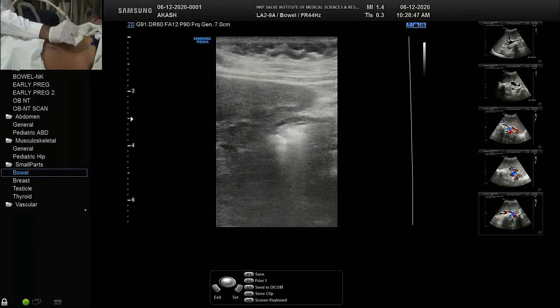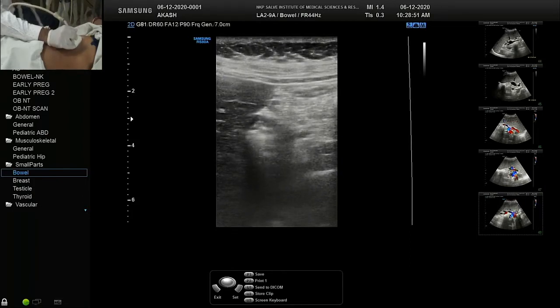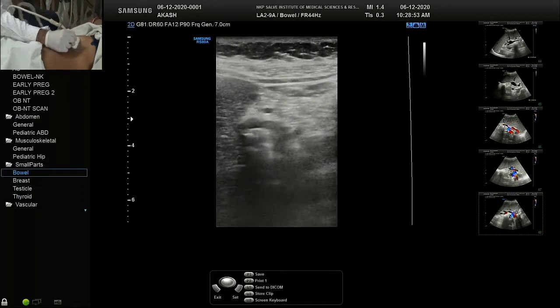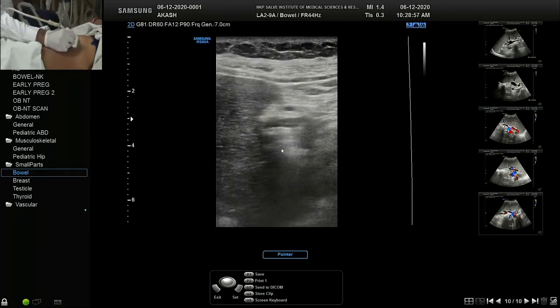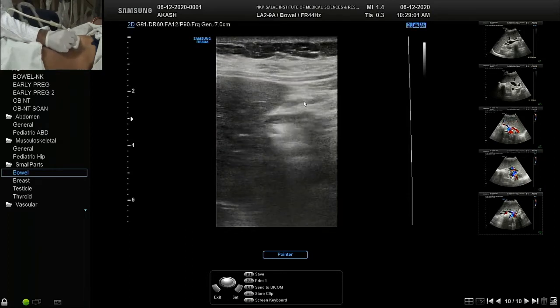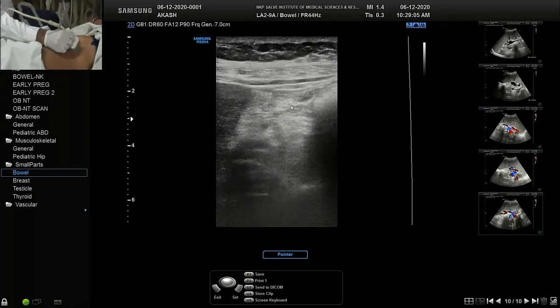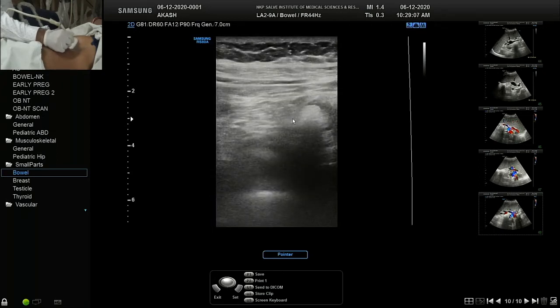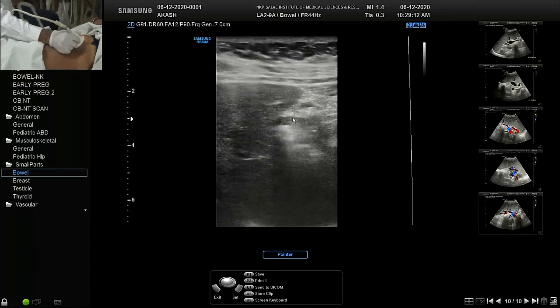So that is it, coming out of the liver here. I think the viewers can identify. Here it is coming out, and then you can trace it. It will go up just below the abdominal wall, and you can trace it down up to the umbilicus.